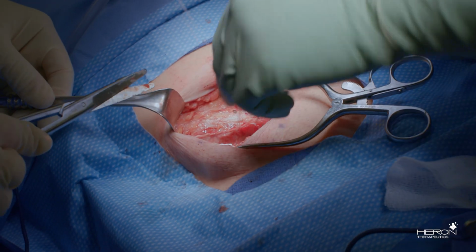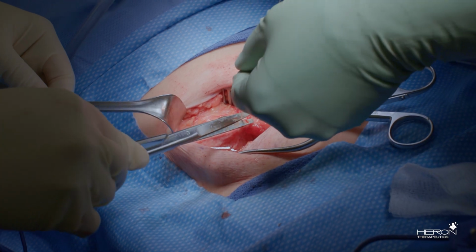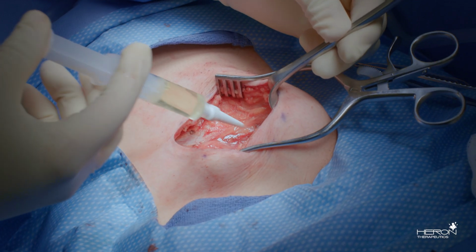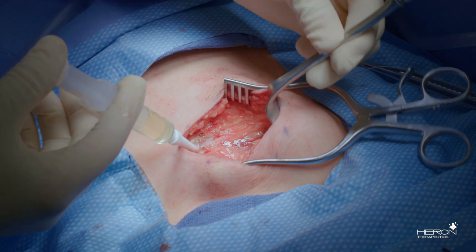After closure of the external oblique aponeurosis, as shown here, apply the final third of the product, again making sure to have good medial coverage and along the cord structures.